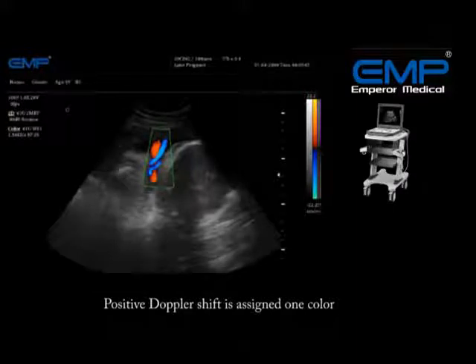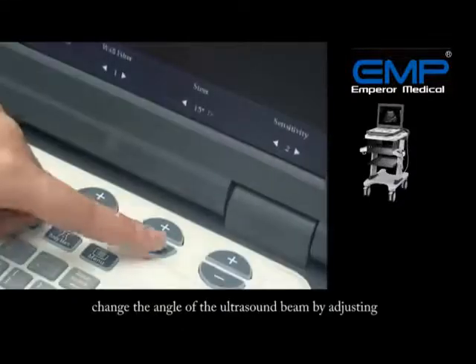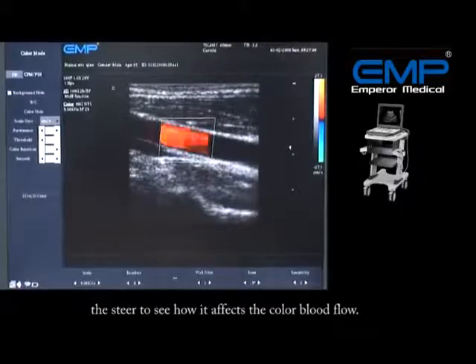Use the SET key to toggle between changing the size and the position of the ROI box. A positive Doppler shift is assigned one color and a negative Doppler shift is assigned another. Change the angle of the ultrasound beam by adjusting the steer to see how it affects the color blood flow.